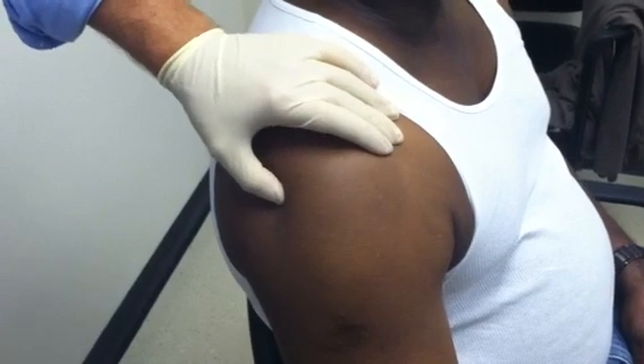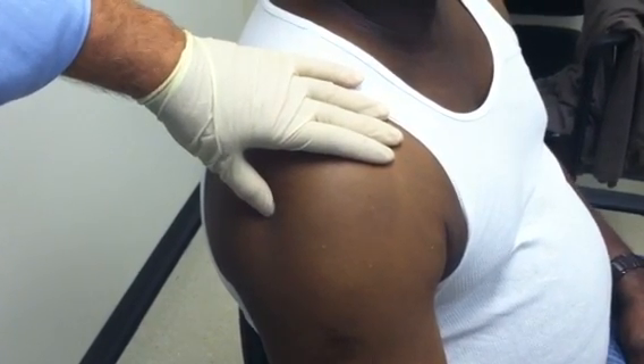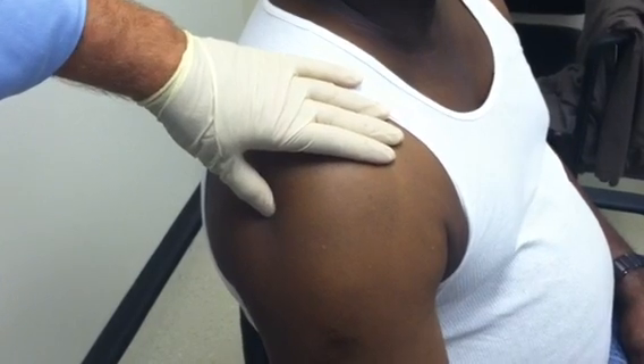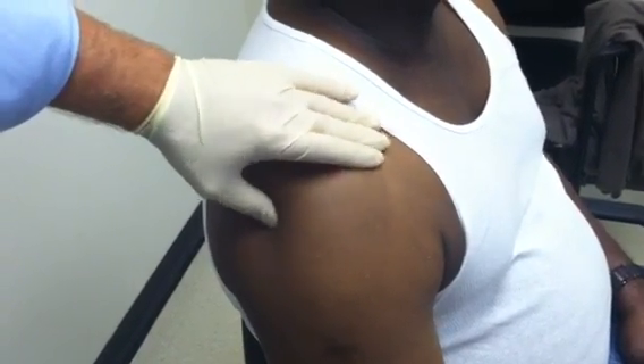If the pain goes away, we've got it in the right spot. It also lets us know where the pathology is, or where the problem is. And if it works, then that'll be the last time you need to see us.